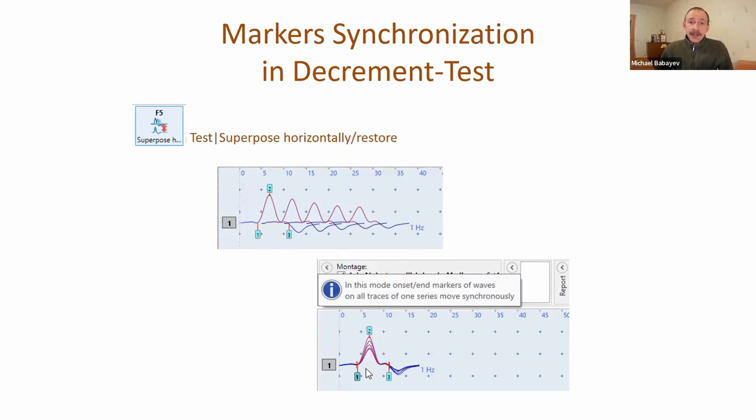We added marker synchronization in the decrement test. You can change the view and superpose traces horizontally. When traces are superposed and you drag any marker - begin or end marker - all markers on all traces will be moved synchronously. This makes it very easy to correct the position of markers.